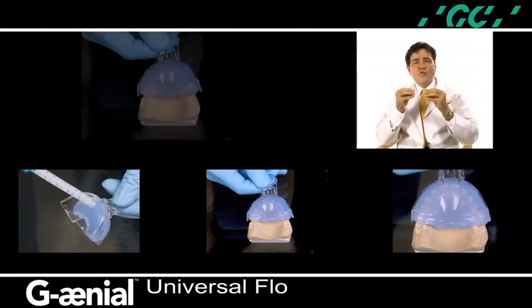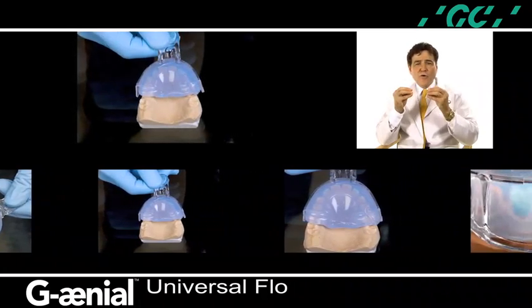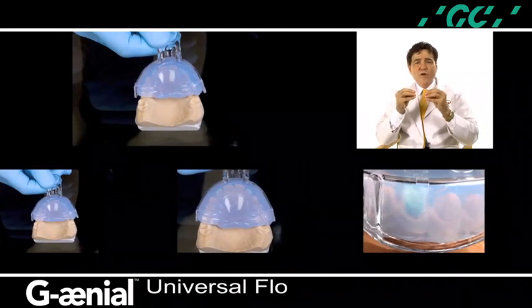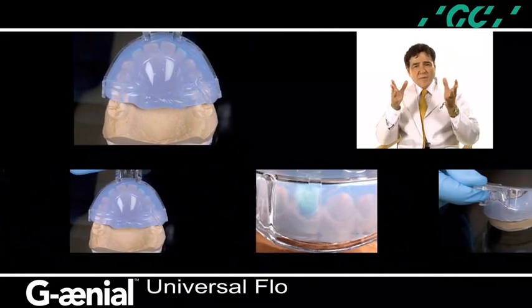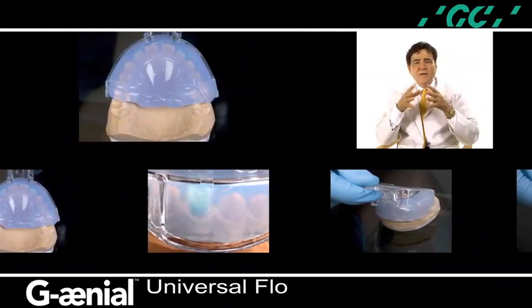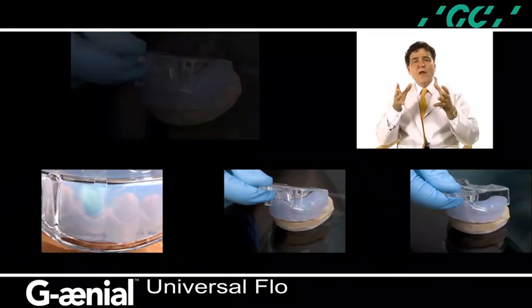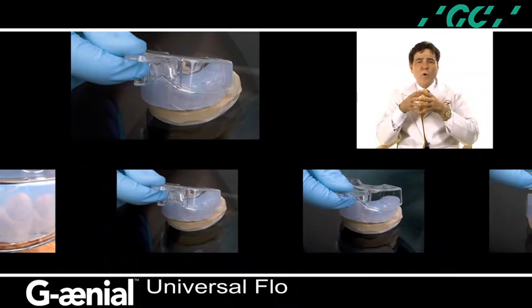Immediately position the tray and material over the diagnostic wax-up model and use a firm and even pressure to seat until the gingival contours of the diagnostic wax-ups are completely encompassed by the material, and leave undisturbed for 3 minutes until the material is set. Notice how easily the tray removes from the model. This was achieved by soaking the model in water.